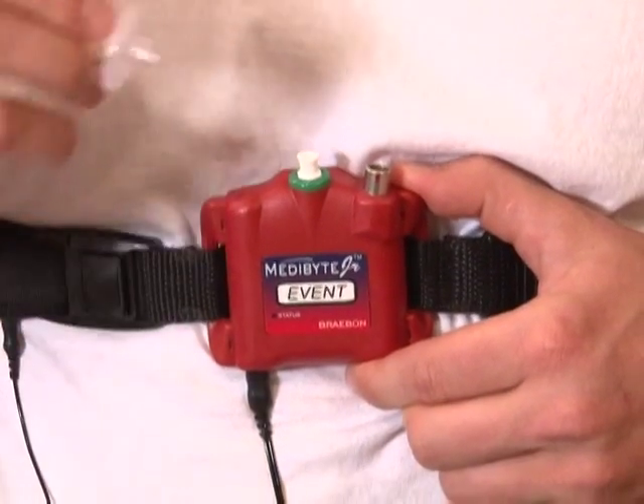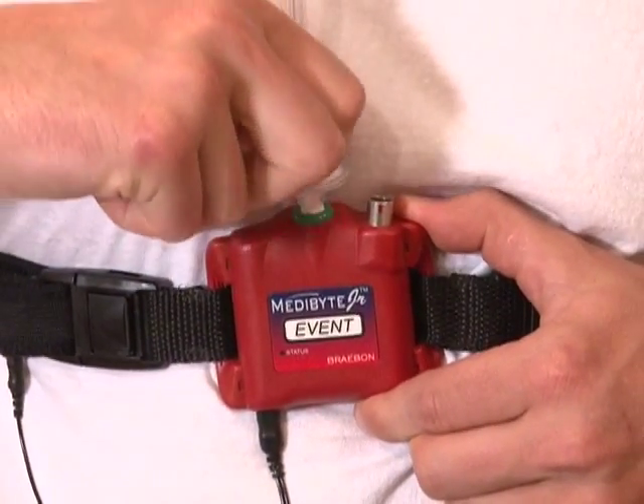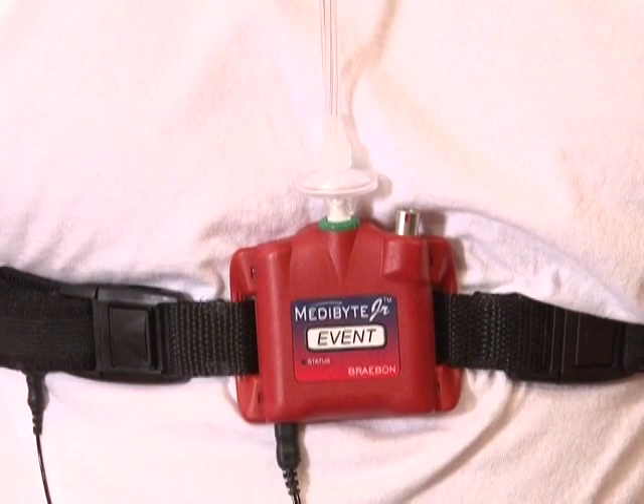You can now attach the connecting end of the cannula into the center port of the MediByte unit, turning it slightly clockwise, making sure not to over-tighten the connector.